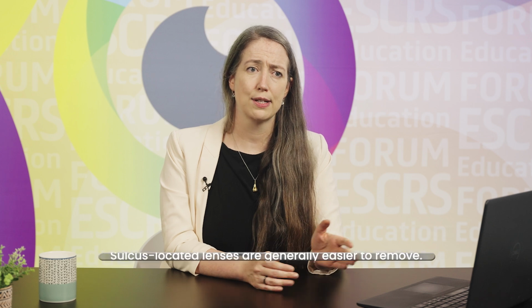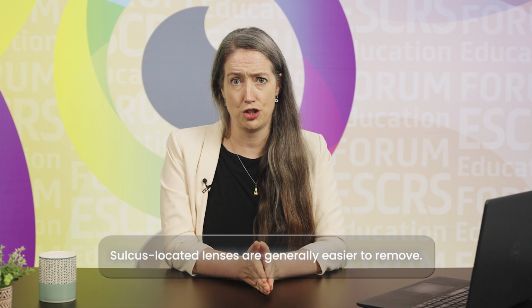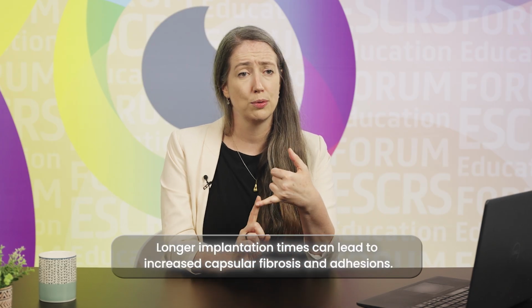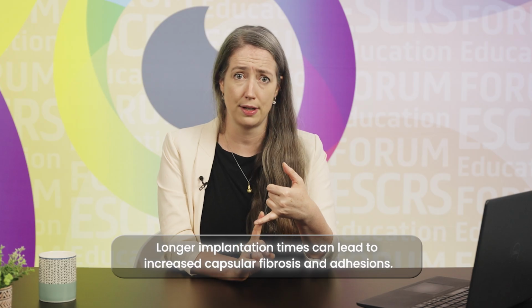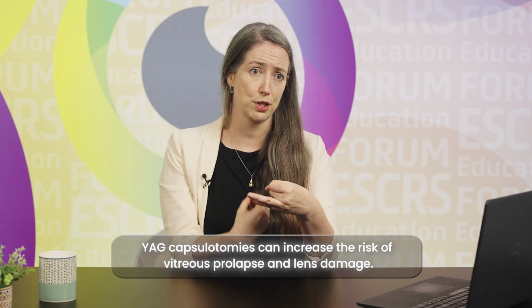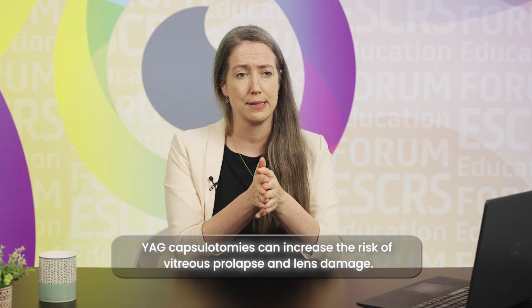There are simple cases and there are complex cases. If a lens is located in the sulcus, it's relatively easy to mobilize. The more difficult issues when you're starting with IOLs is the length of time that it's been in the bag. There will be more capsular fibrosis and adhesions the longer the lens is in place. The second problem is whether they've had a YAG capsulotomy. This not only creates an opening for vitreous to come forward, it also makes it more prone to tearing, ripping, and dropping the lens. So if you can do it without having a YAG capsulotomy, or if you think a patient might need a lens exchange in future, don't YAG.